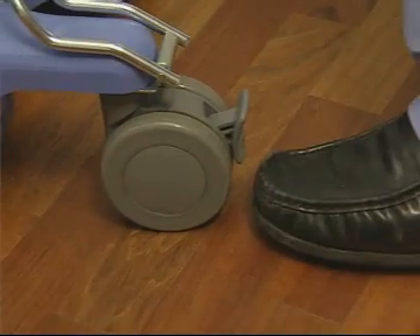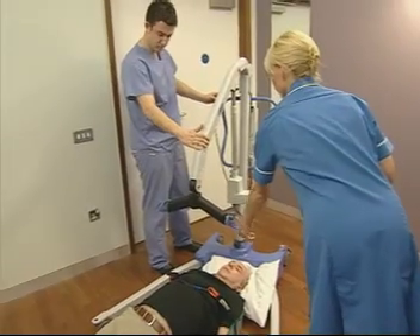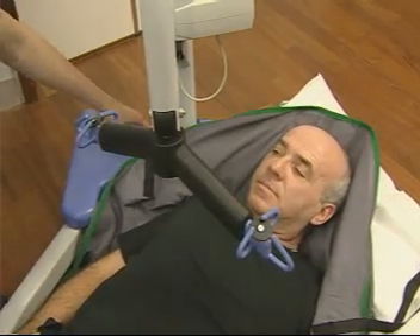For this manoeuvre, the brakes will need to be applied. Bring the cradle down so that it's level across the patient's chest and at a height where the straps are easy to attach.